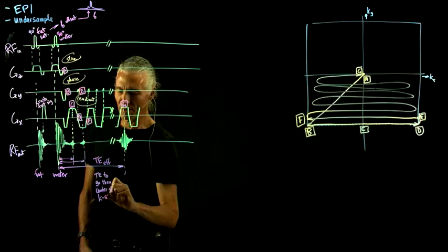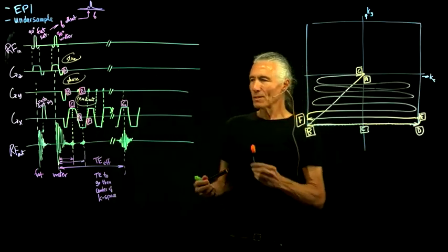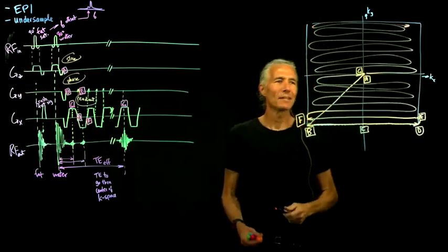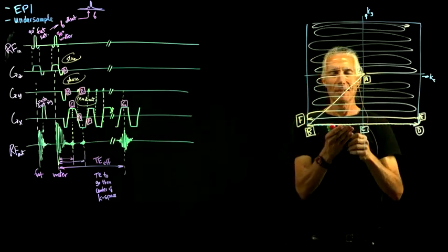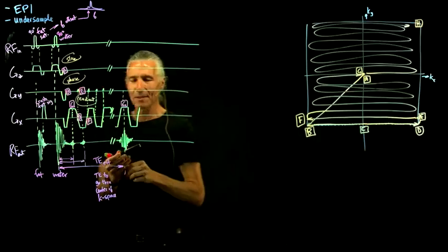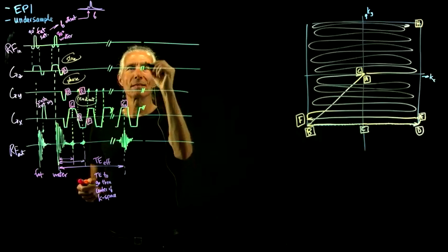The low spatial frequencies are the ones that most strongly affect the overall contrast in the image. But we're still not done yet, and now we have to collect the whole rest of K-space, sloppily like that. By the time we eventually get to point H, we've finally recorded all of it. There'll be another gap where we record the whole rest of K-space.